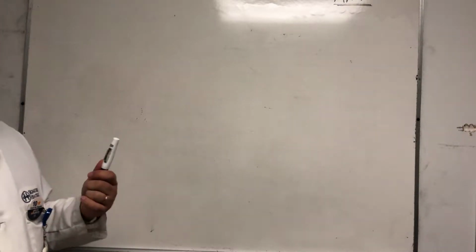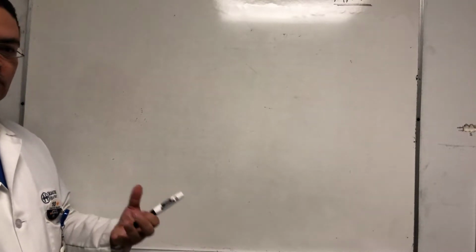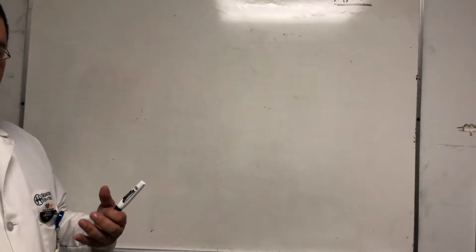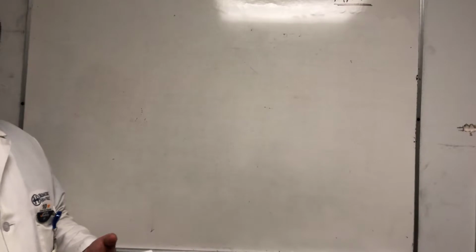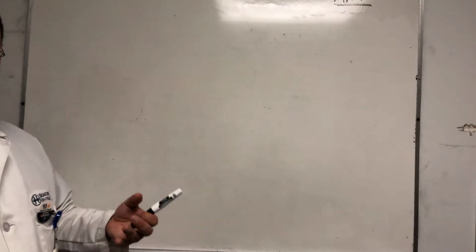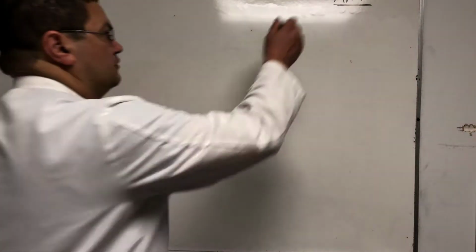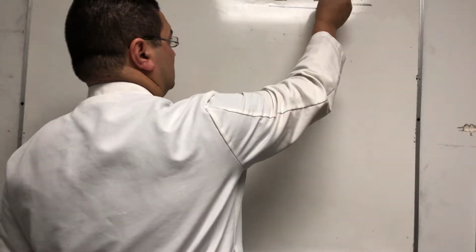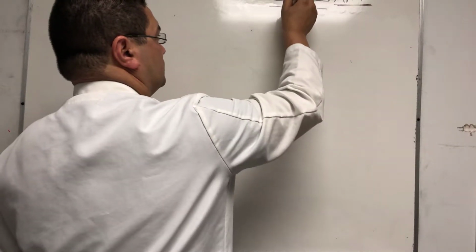But anyway, the need for this happened when we had patients on inverse ratio pressure control. They have to be paralyzed, like we talked about yesterday, right? When patients are on inverse ratio pressure control, they have to be paralyzed because they're very, very hypoxic. And inverse ratio looks like this. Okay, that's pressure control now. This patient has to be paralyzed.